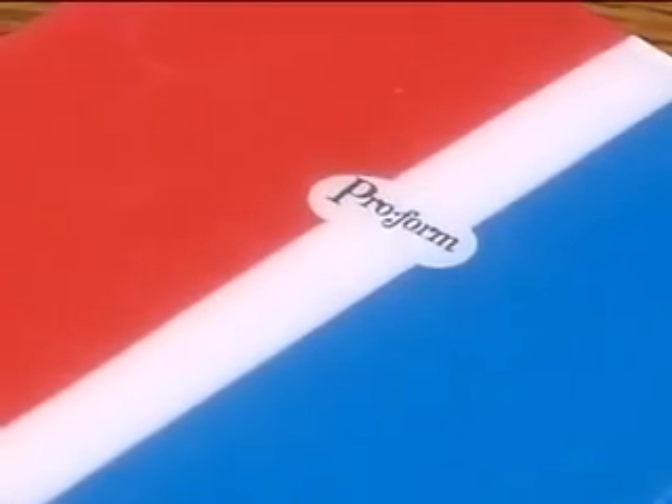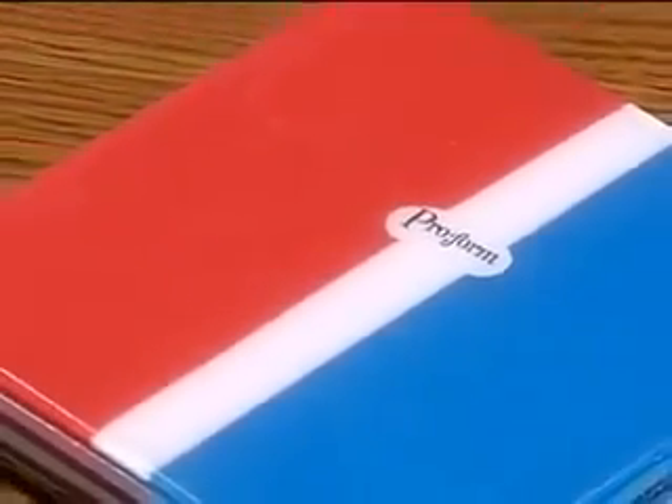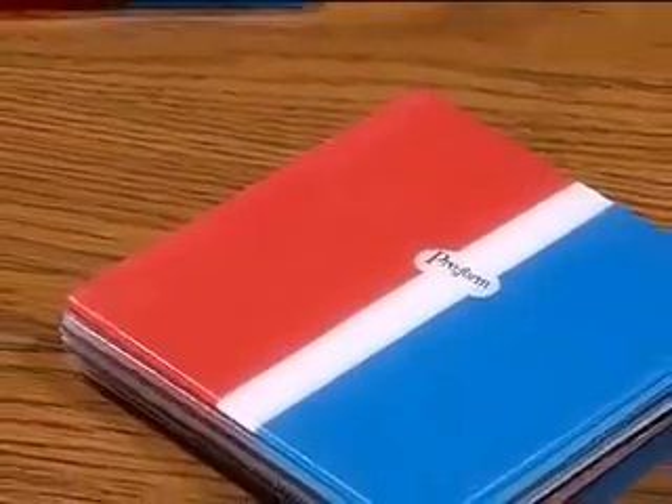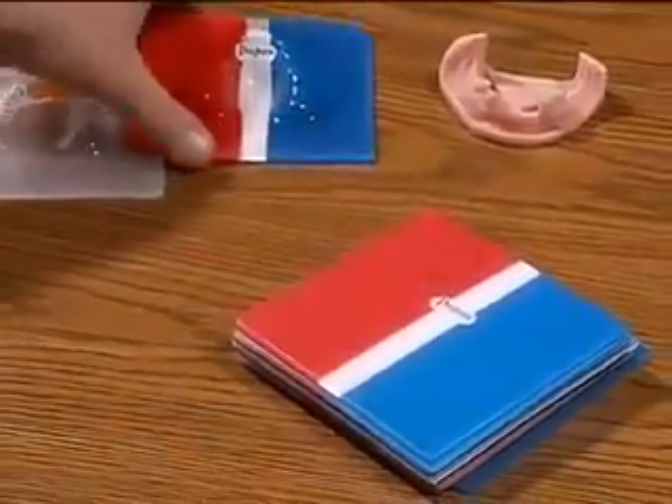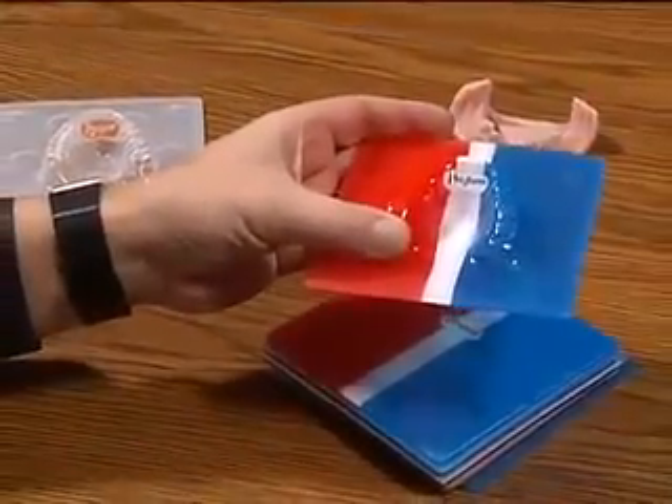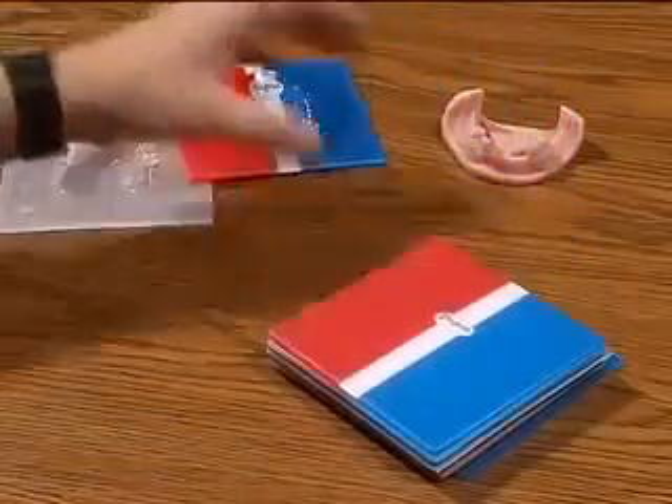Next, let's talk about the actual products we'll be vacuum forming. First off, we have the ProForm material, which is identifiable with the center logo ProForm. It is positioned when we vacuum form on the linguals of the teeth to help reinforce the anterior section against impact.